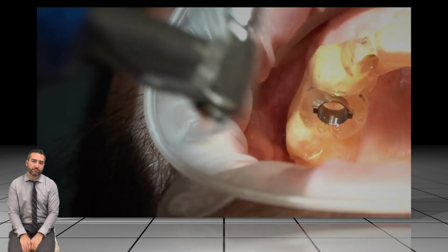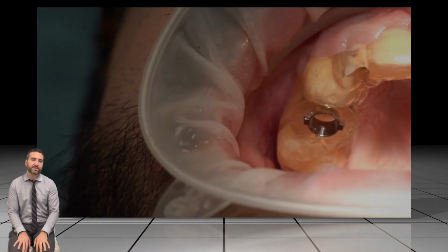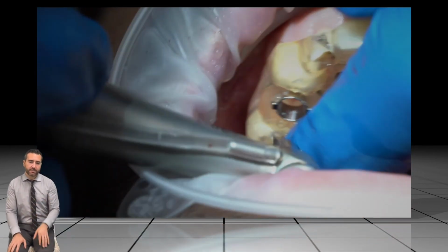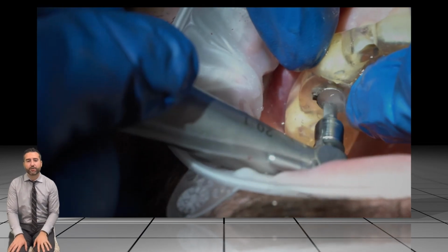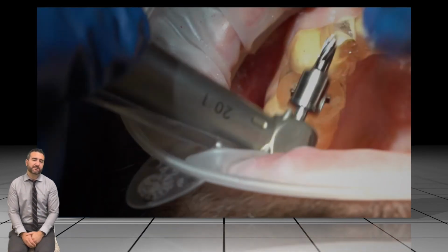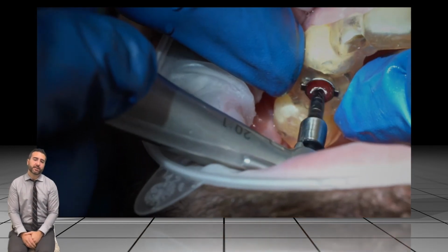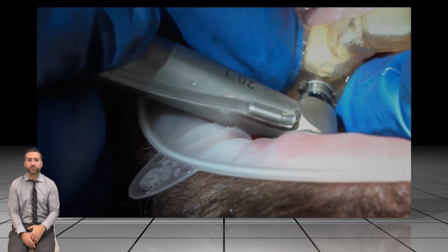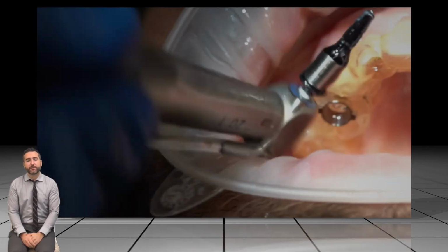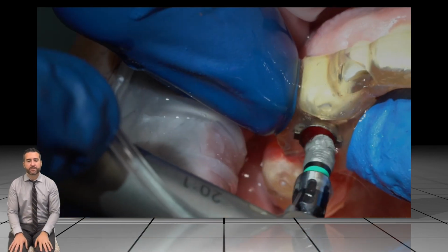They took an Advil. So sedations go way down when you explain this, because patients' anxiety levels go way down because you're telling them that you're using the latest technology to ensure that everything's going exactly where it is, and that there's pinholes, and that there's not huge surgical procedures, unless of course you need to, like whether you need to do a flap to preserve keratinized tissue, or if you're grafting with the implant, of course there's still definitely a place for that. But as you can see here, the whole process is, for each implant, under 10 minutes.